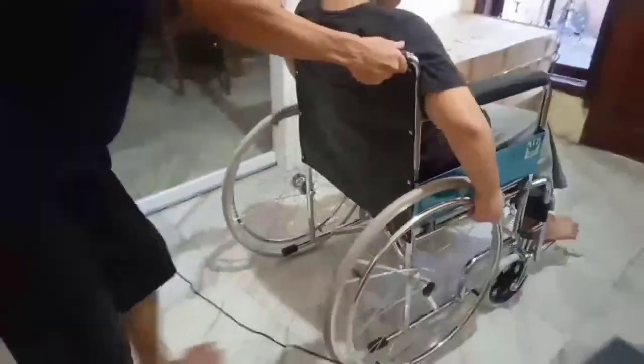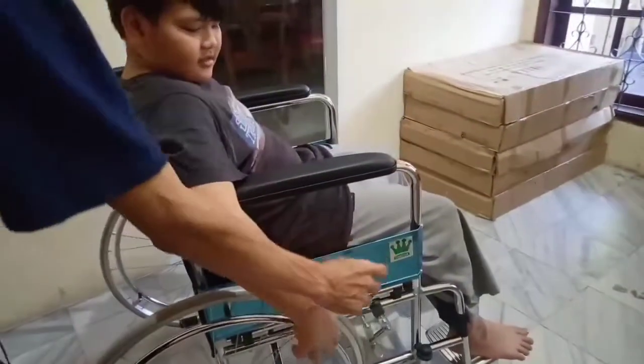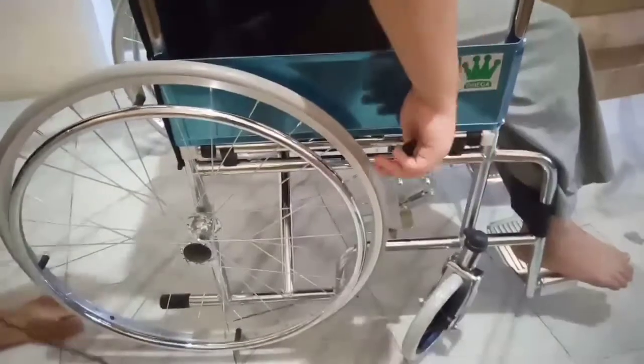Kalau buat jalan ini, nah kita tinggal dorong ya. Nah ini rimnya kanan kiri — rim tangan. Otomatis ini sudah, kita tekan rimnya. Nah otomatis ngeram ya.